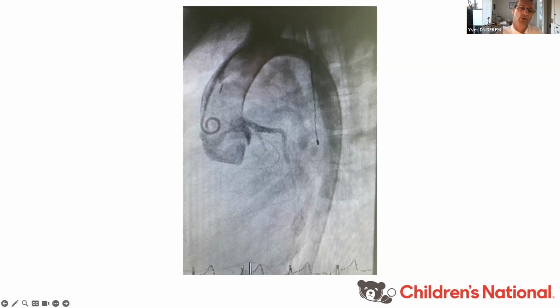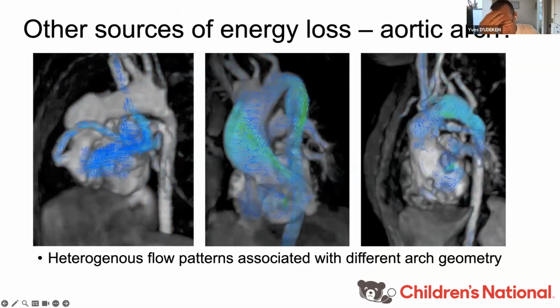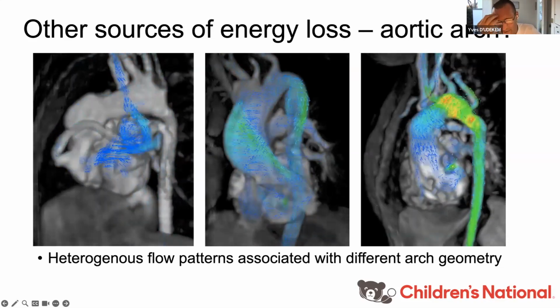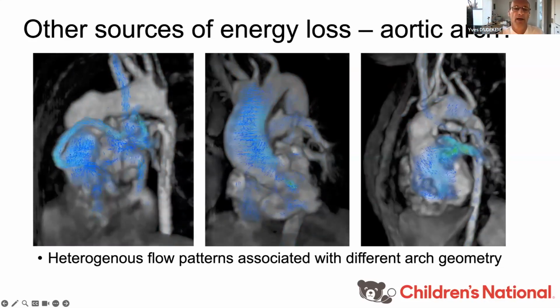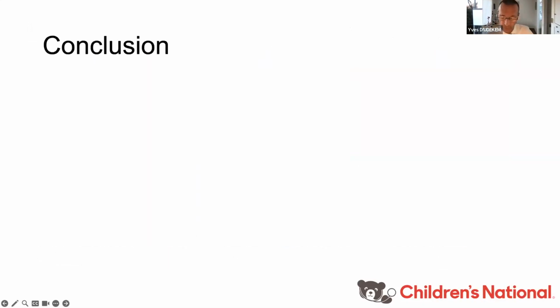And I find myself caught numerous times where the aortic arch is obstructed, but the numbers given by the cath do not give me an obstruction. And I think we've been focusing on a gradient, but in single ventricle situations, the flow can be affected in a way that the gradients are not extraordinarily high. And I've made a paper saying that we should do cosmetic surgery on these arches. Again, 4D MRI helped me in this matter.